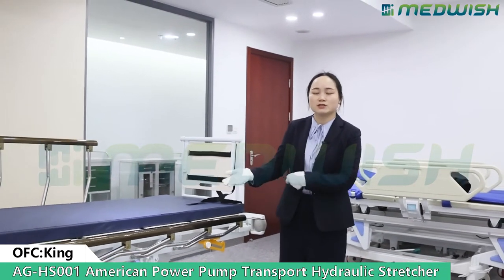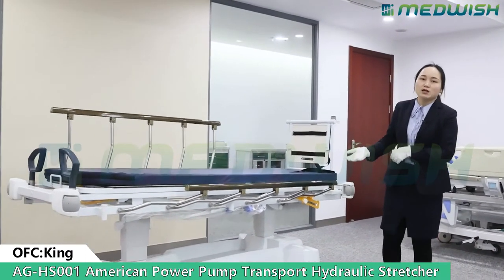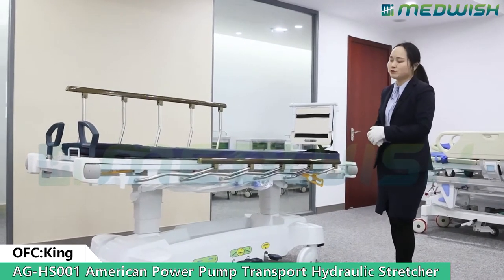Dear partners, today it is my honor to introduce our hydraulic stretcher. This stretcher is made with two American power brand pumps. It is very durable and stable even after many years of use.